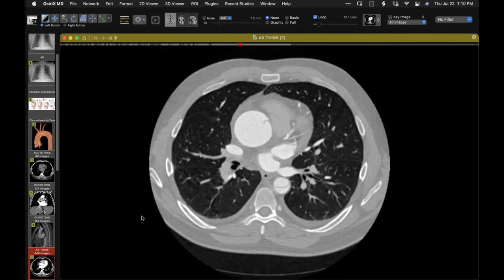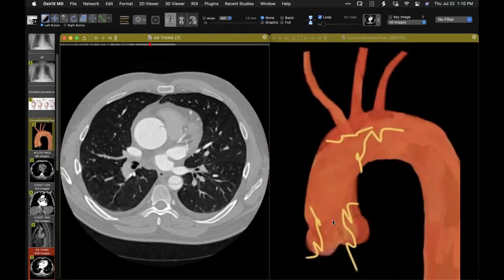So when one sees that, one should wonder about the situation in which one has a circumferential tear of the aorta. In that situation, depending on the extent of the tear and so on, one may get a situation where the distal flap may, doesn't have to, but may go distally and form an intimo-intimal intussusception, kind of a windsock phenomenon. But in relation to the proximal intimomedial flap, and here's sort of an empty portion of aorta, it may prolapse backwards through the aortic valve in diastole.